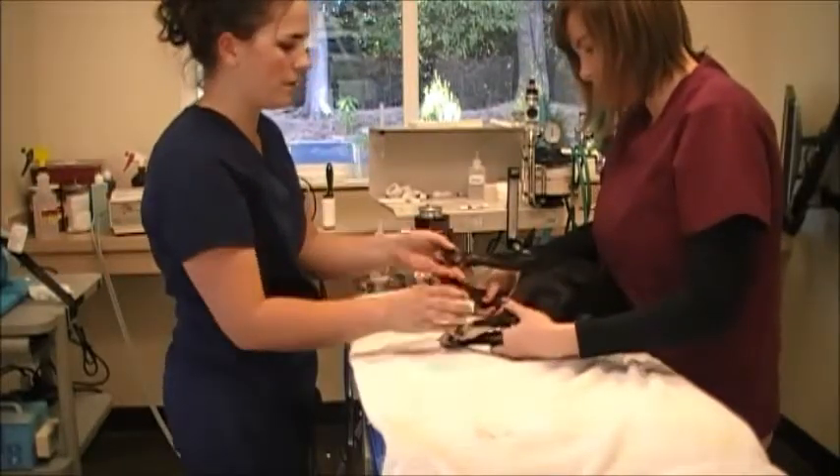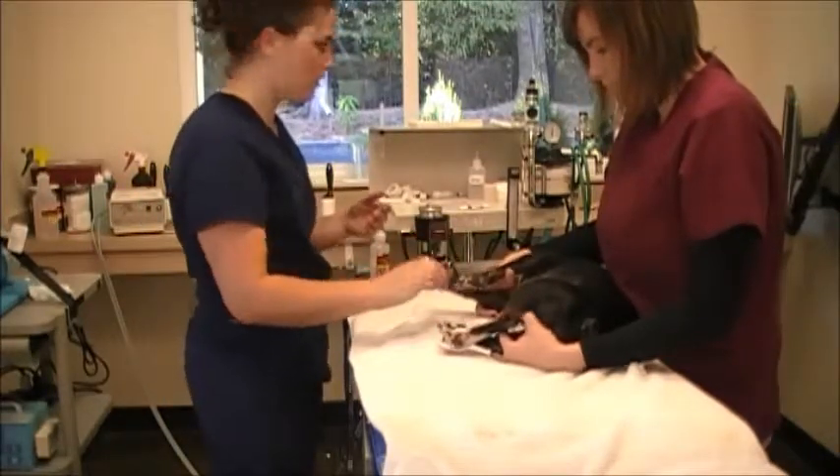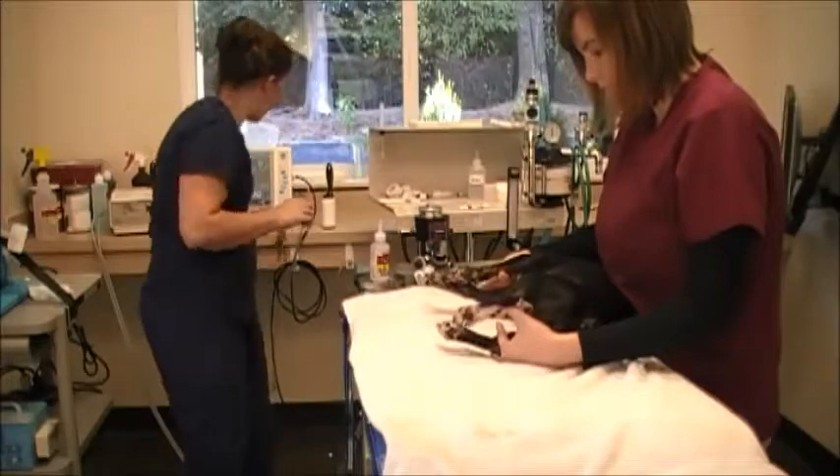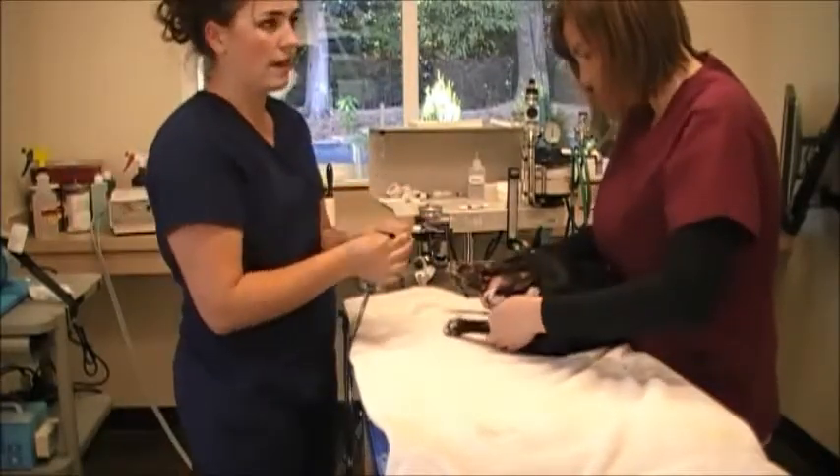I'm going to make sure that her limbs are perpendicular to the body when I put in all the leads, and not touching each other also. I've got my leads — a white lead, a black lead, and a red lead.